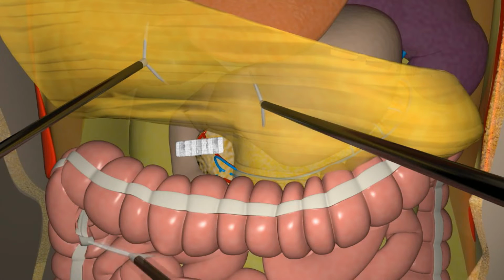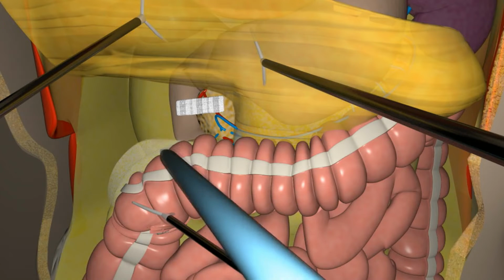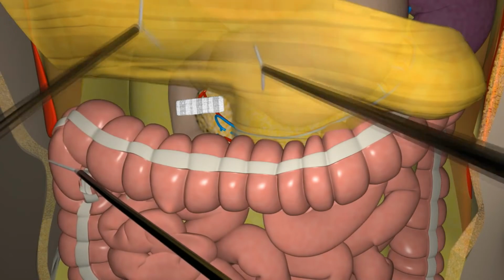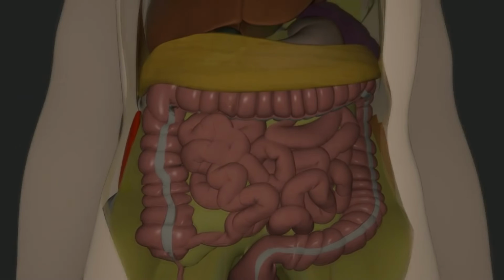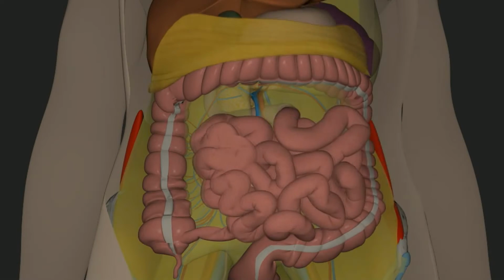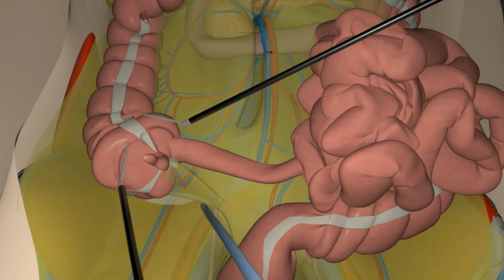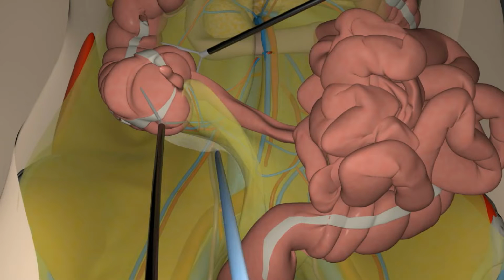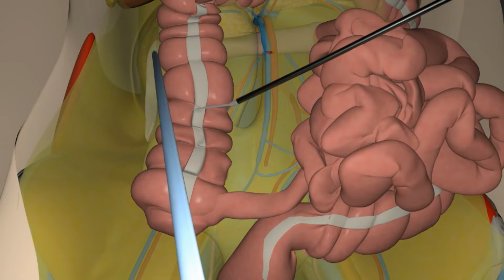As the gastrocolic ligament is divided, the area of retroperitoneal dissection, the duodenum, and the pancreas becomes apparent. Once this area has been entered, it becomes clear that the only remaining attachment is the lateral peritoneal attachment along the ascending colon. This area, the white line of Toldt, is divided right down to the base of the cecum, and it may even be possible to completely mobilize the appendix and the base of the cecum to the midline from this direction.